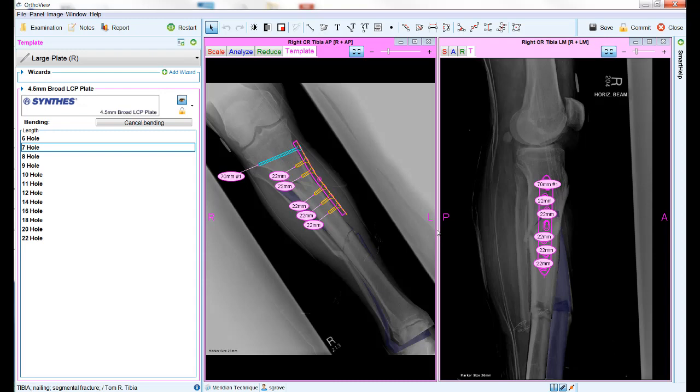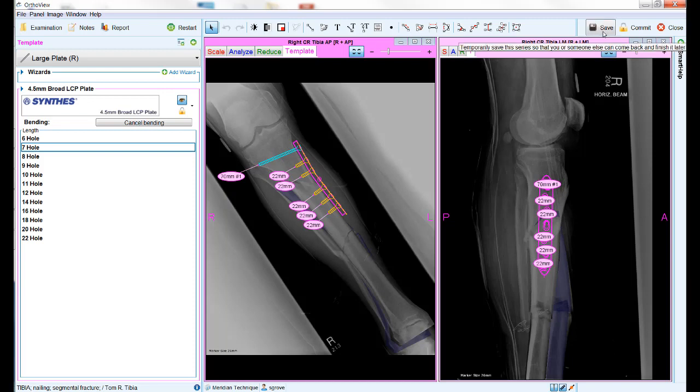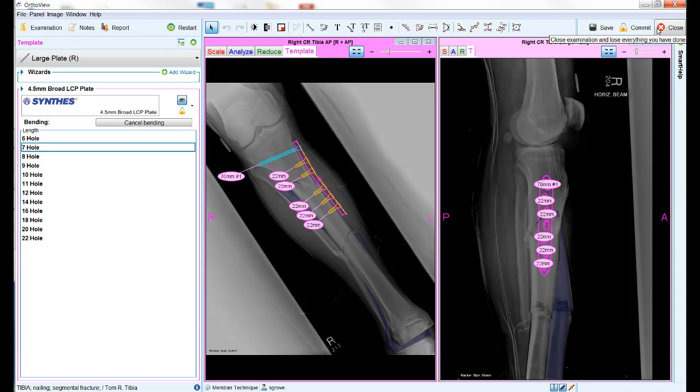Once you have finished your plan, there are three choices at the top right of the screen for storing your plan: save, commit, and close. If you do not wish to store a copy of your plan, simply select close and the work will not be saved.